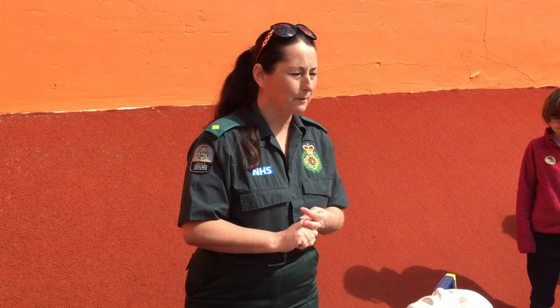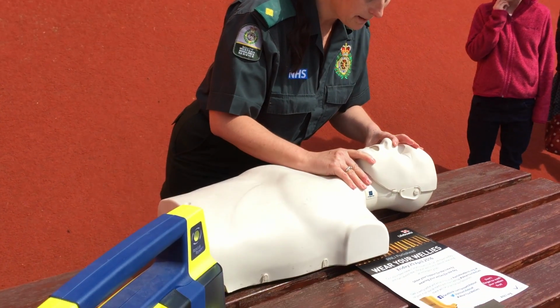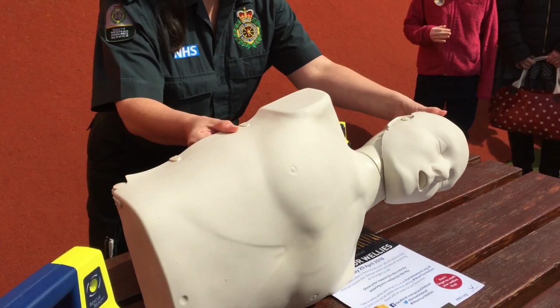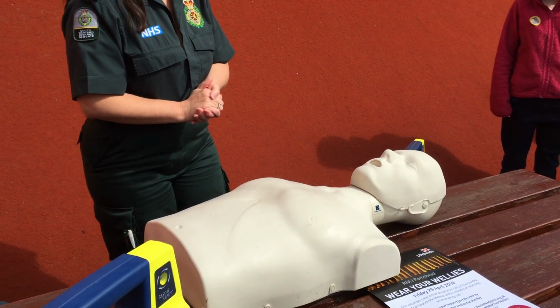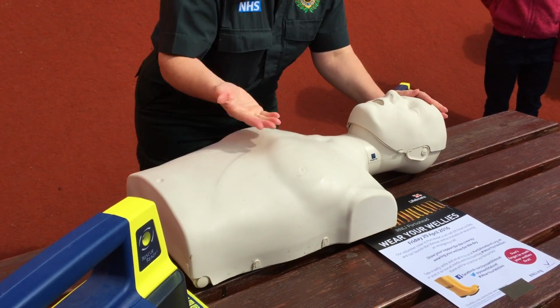Okay, so what are we checking now? Airway, yeah. So I'm just going to look in the mouth, see if there's anything in there. If there is, you can just turn the patient to the side and let anything drain out of the mouth. And now what are we checking? Breathing? Yeah, for how long? 10 seconds. Remember to tilt that head back.